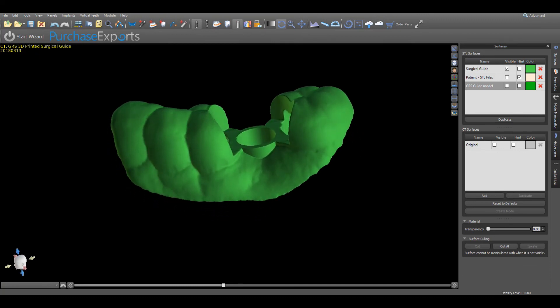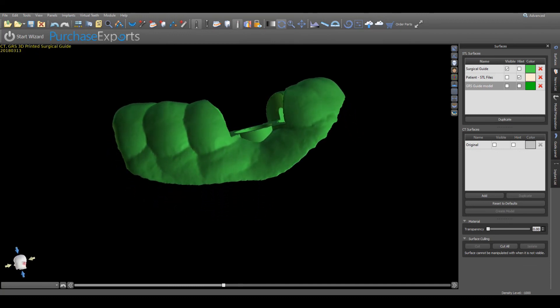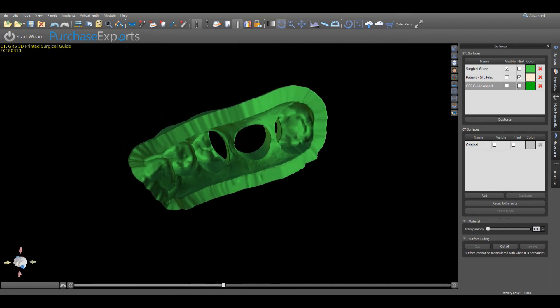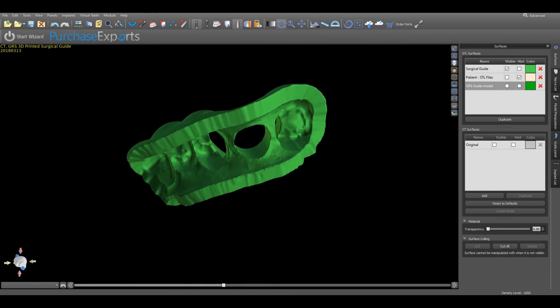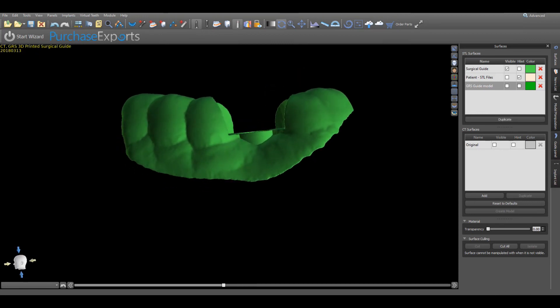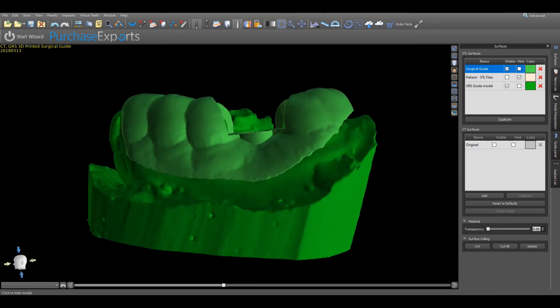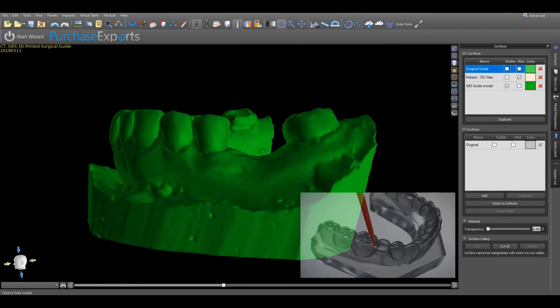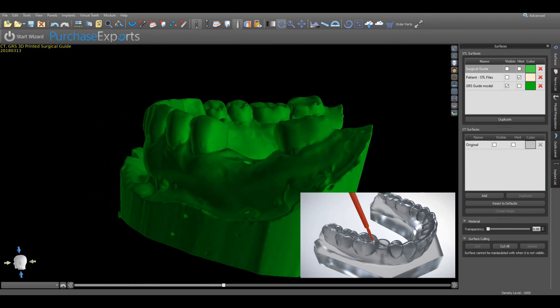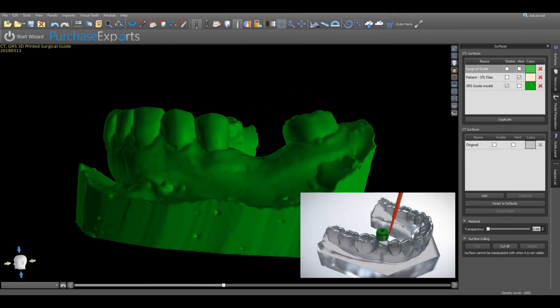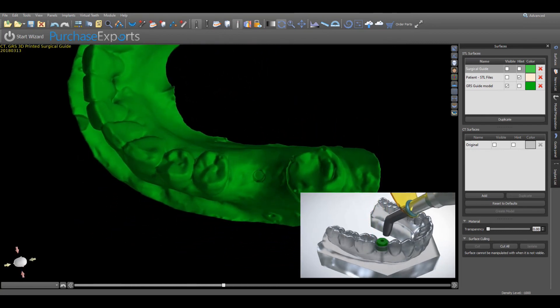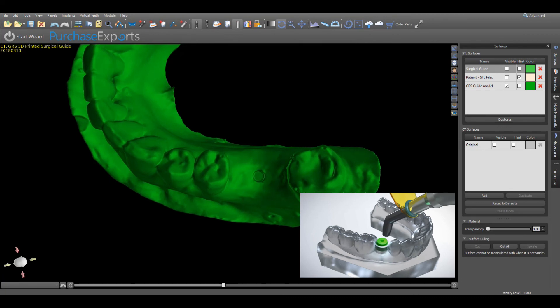Once the surgical guide and model have been 3D printed, make sure to seat the guide on the model and make all necessary adjustments to ensure a stable and comfortable fit. After confirming the fit, insert the proper GRS surgical ring into the surgical guide and affix with the medical grade adhesive. Additional videos demonstrating how to affix the surgical ring to the surgical guide are available at GRSGuidesystem.com.